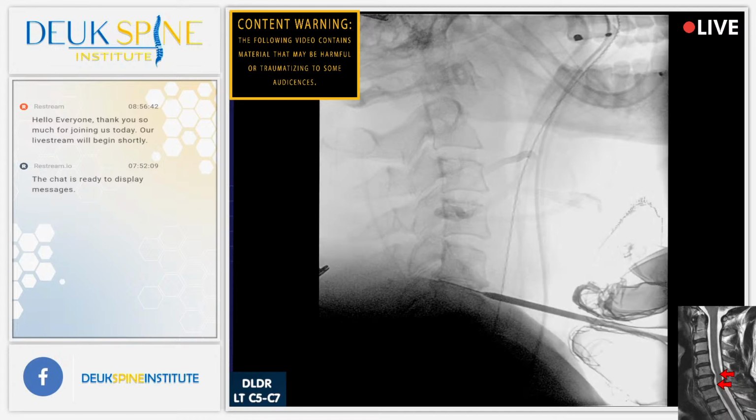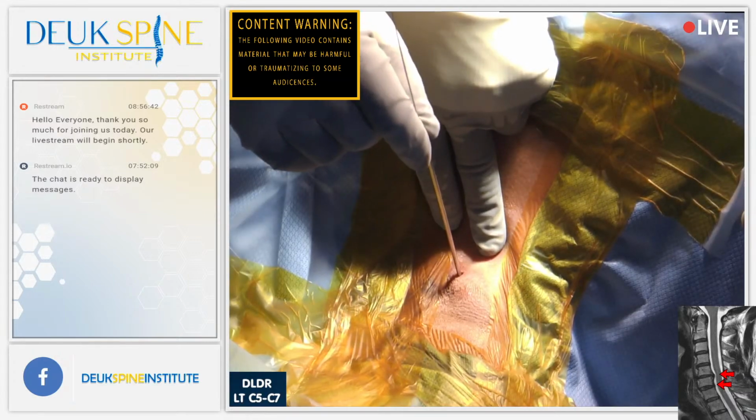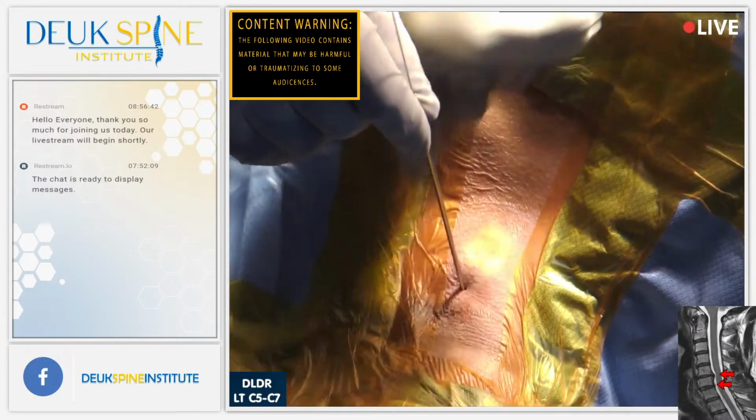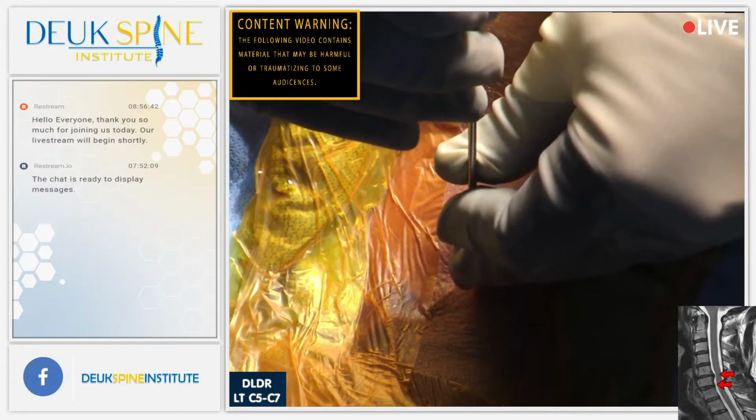That way, we're tabulating how much radiation we're exposing the patient to. And I know it's this very small amount. Now take a look here, guys and gals. See the little hole, the incision around this tube right there? There's just enough room to get a little bit larger tube in. And that's the tube we're going to do the surgery with.